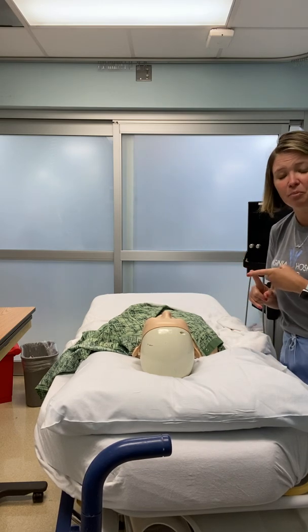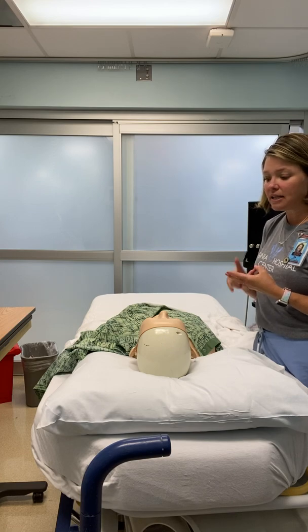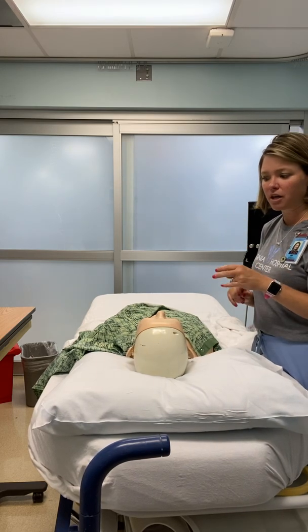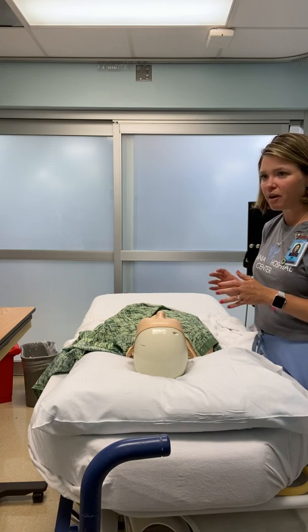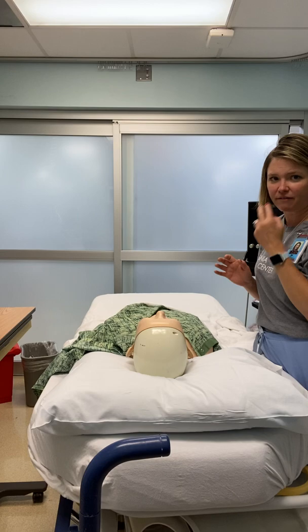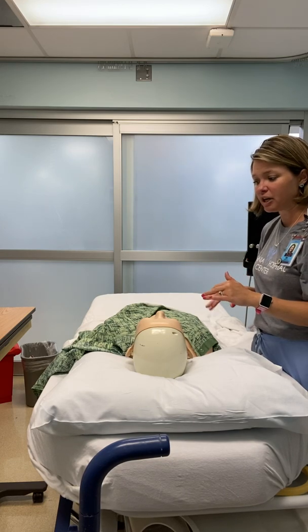A couple of key points about that. All nurses caring for patients with continuous catheter infusions are expected to take the LAST training in HealthStream. Key symptoms we are looking for are a change in their heart rhythm, blood pressure, dysrhythmias, those sorts of things. So we have our patients on a heart monitor at all times. We have our blood pressure cuff and our pulse ox running at least every 5 minutes. And we also have 2 liters of oxygen running by nasal cannula, just to ensure that if something were to happen, they would already have that in place.